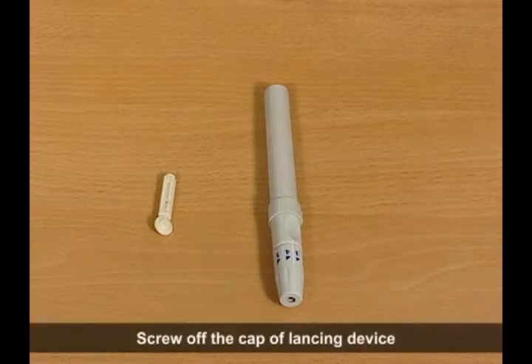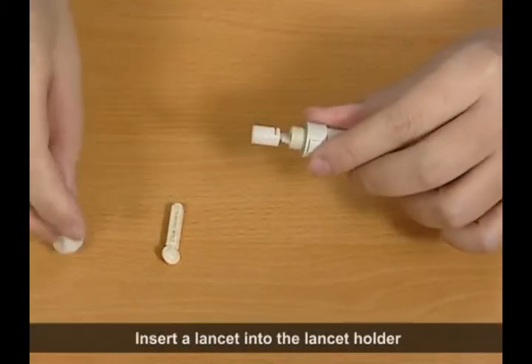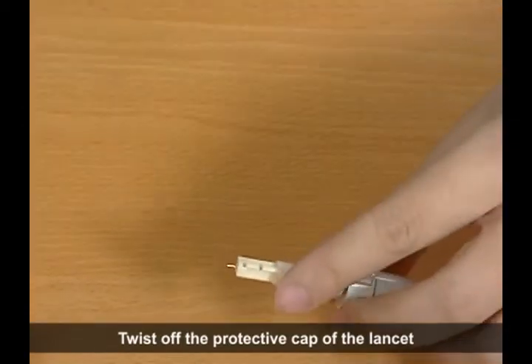Set the lancing device. Screw off the cap of the lancing device. Insert a lancet into the lancet holder and push down until it is fully seated. Twist off the protective cap of the lancet.